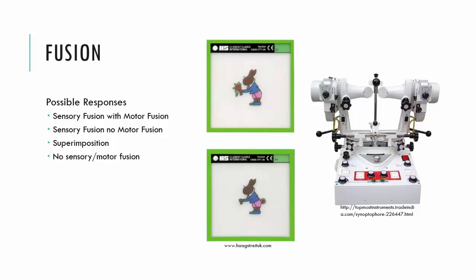They can see from the right eye and the left eye, but they are unable to fuse the 2 images into one. Sensory fusion is absent. And given that sensory fusion is absent, they will not be able to demonstrate motor fusion. So as soon as you go to converge or diverge the tubes, the patient will immediately have diplopia or see those images side by side.